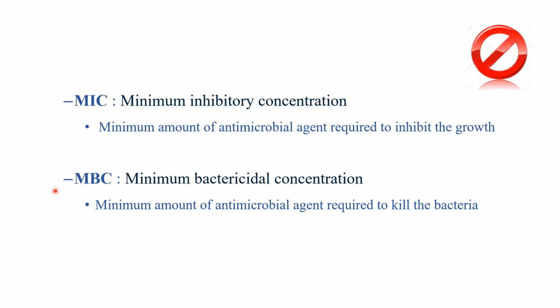MIC means minimum inhibitory concentration, that is, the minimum amount of antimicrobial agent required to inhibit the growth of a particular organism.